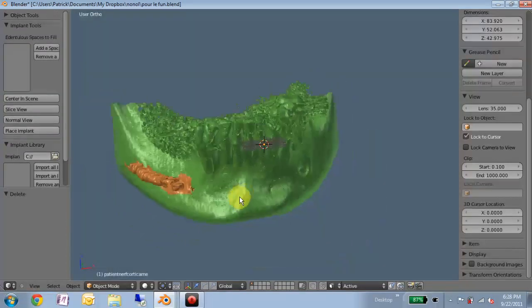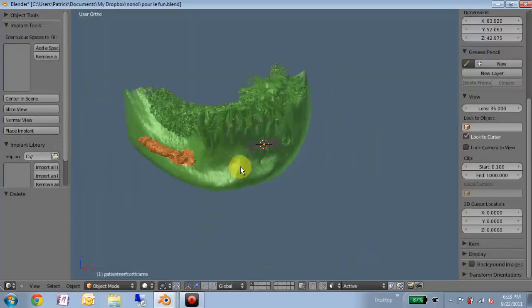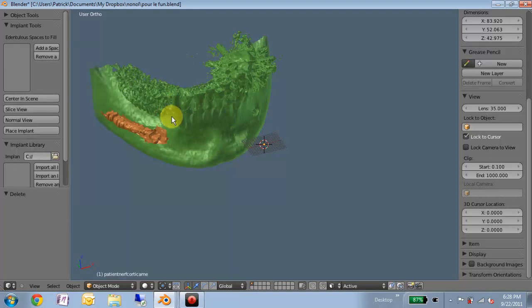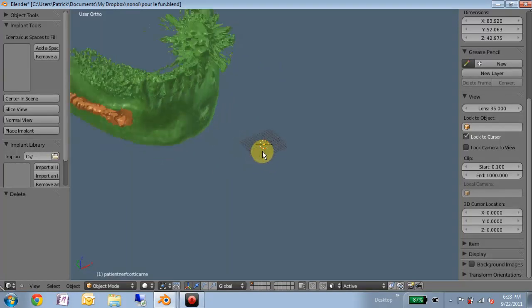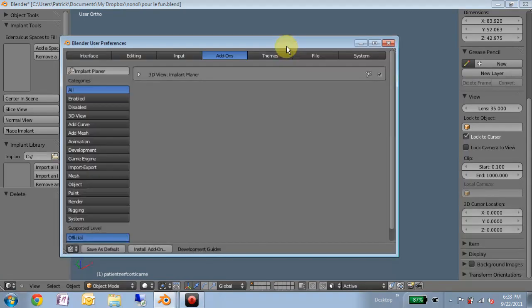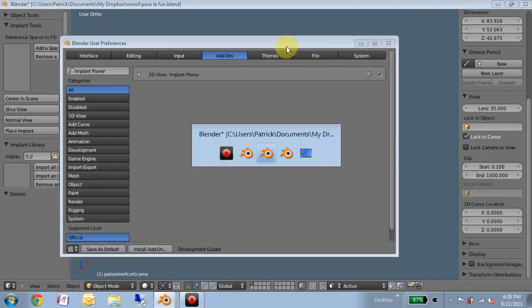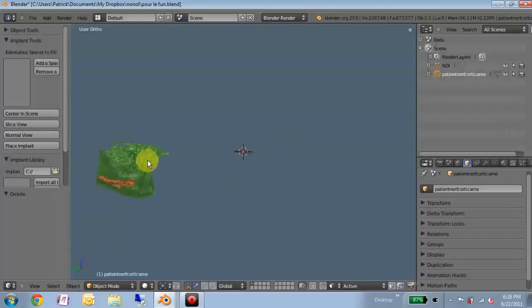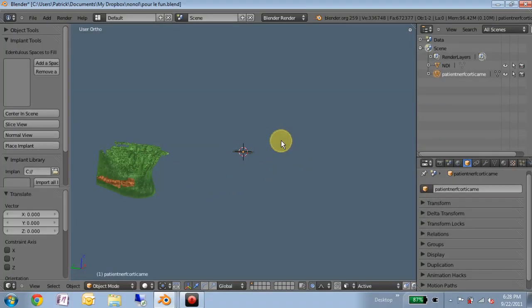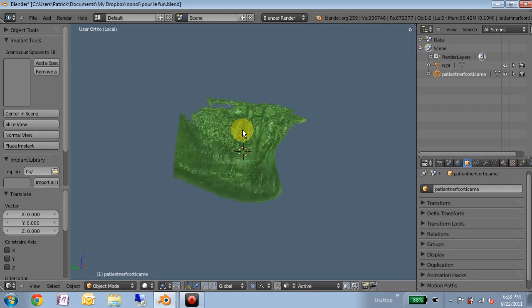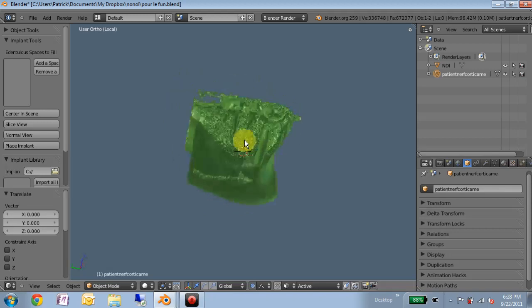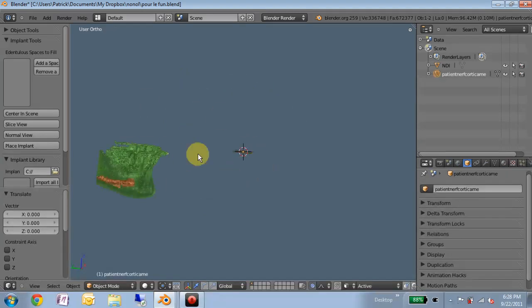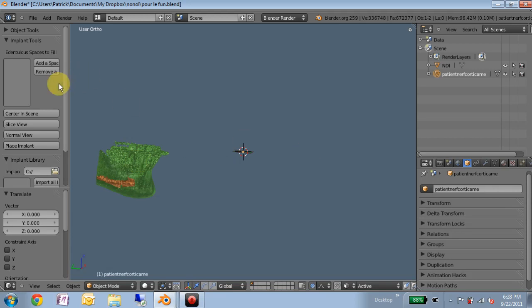A lot of times I've noticed that the file representing the bone is not centered at the origin. So this is not a huge problem if you want to use local view. We can simply select it and use local view to limit what we're looking at and center us on that object. The problem is this causes some trouble when I'm trying to place implants at the 3D cursor.